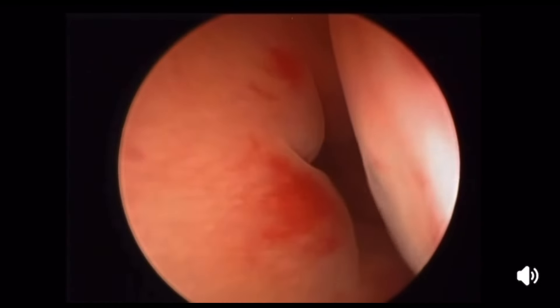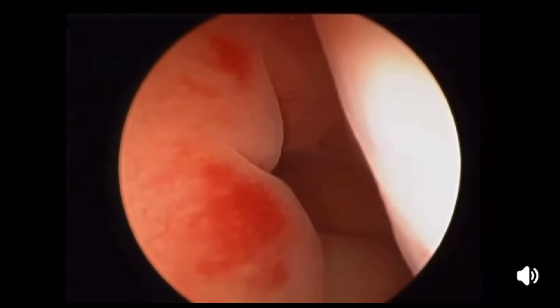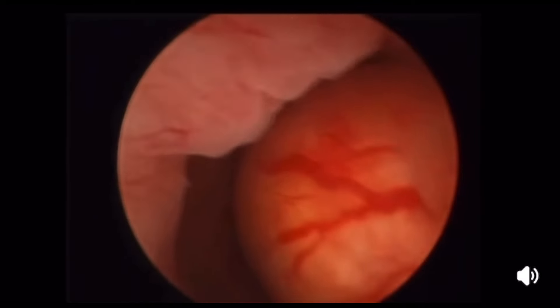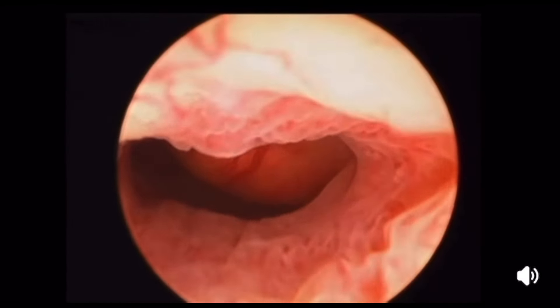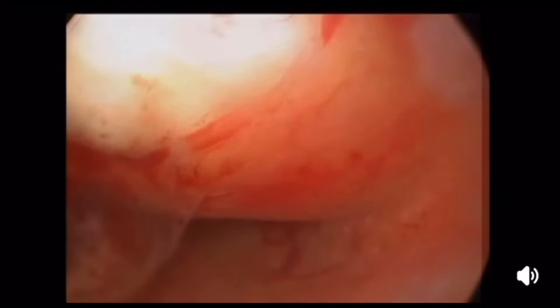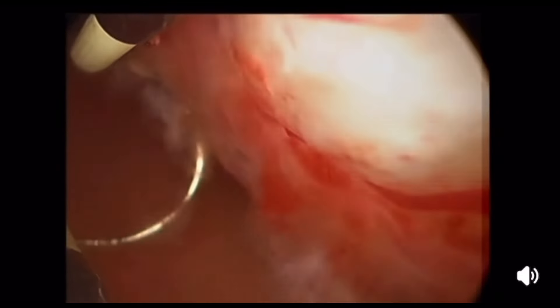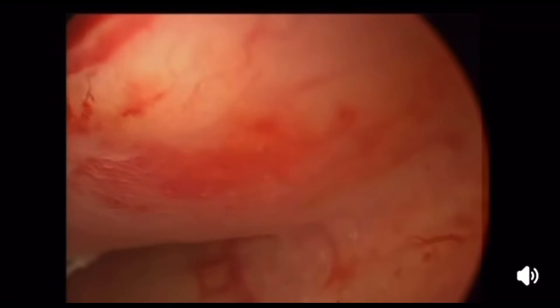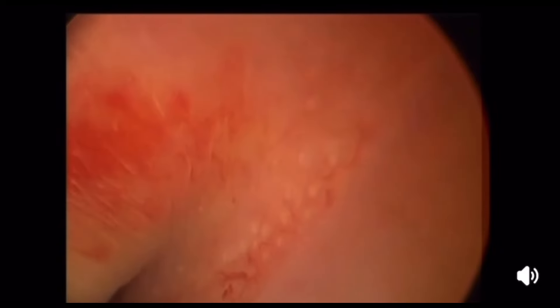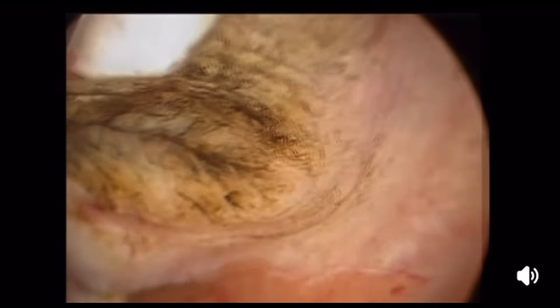This shows a large submucous fibroid almost filling the entire uterine cavity. You can assess the size by comparing the mass to the cavity — the uterine cavity is about four centimeters, so this is around a four-centimeter submucous fibroid. The base is posterolateral, as you can see, and there is some deep part inside the myometrium. So this is a type one submucous fibroid.